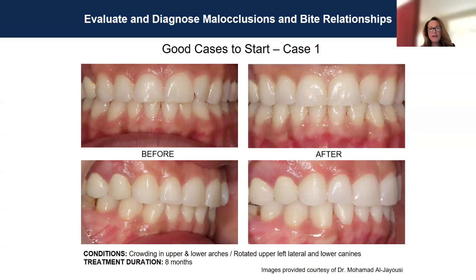Yes, and unfortunately, as we age, myself included, depending on your malocclusion, your teeth can distalize a little bit, correct? So if you are having food traps, yes, that would fall under a mild case. Sometimes you have to have a little bit of IPR along with that to close it up a little bit more.